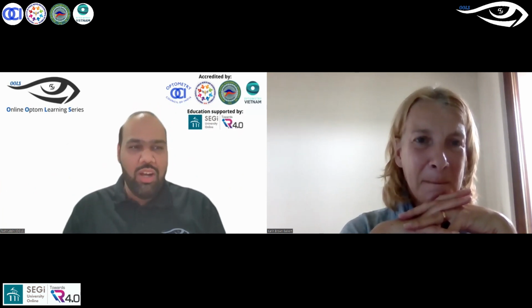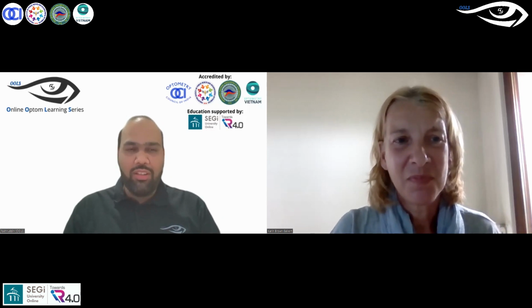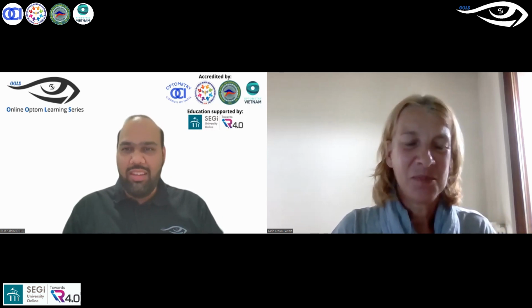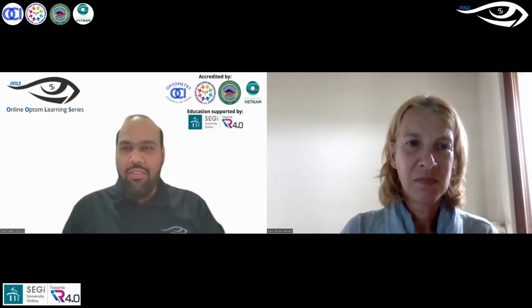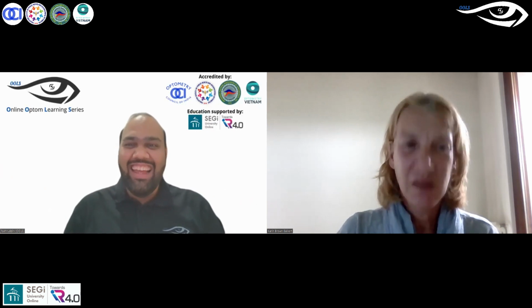It's a bit new to this part of the world, I would say, and I think it is getting more popular because we now understand by research, as you well presented, that less than 6% of the sclera is spherical. And most of our trial lenses are with spherical haptics, right?